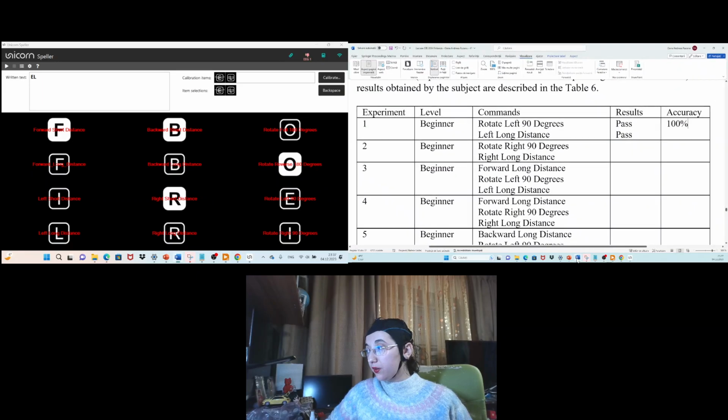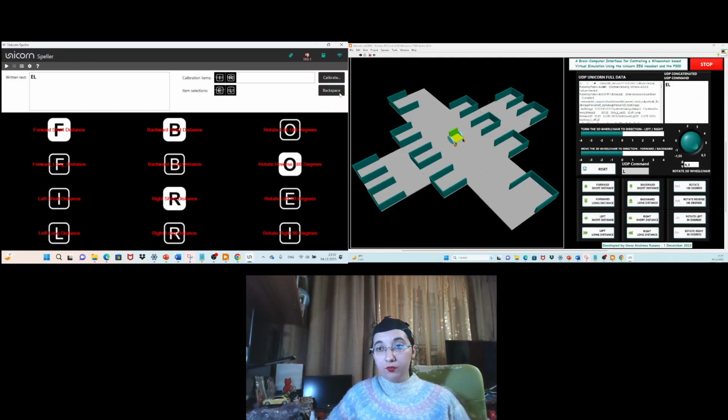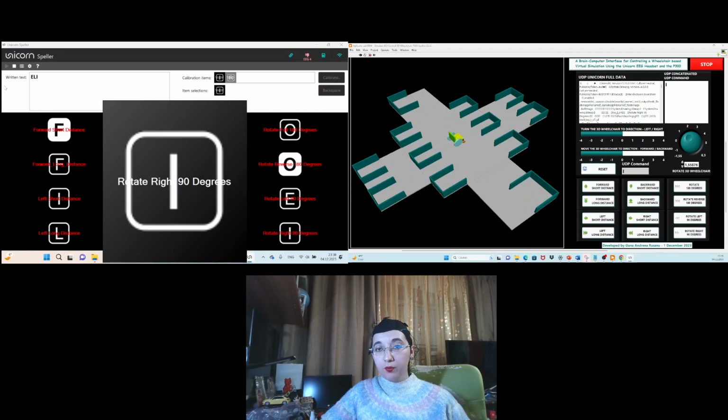Okay, we will continue with the next commands. So we will have rotate right 90 degrees, this one, and right long distance, 2 commands. So this one and this one. Perfect.